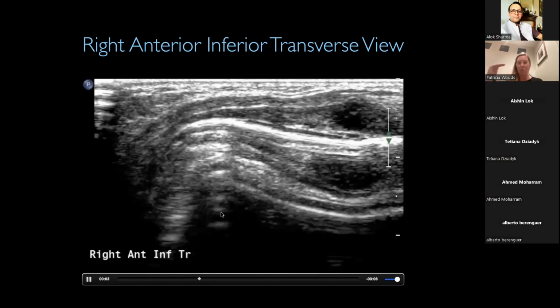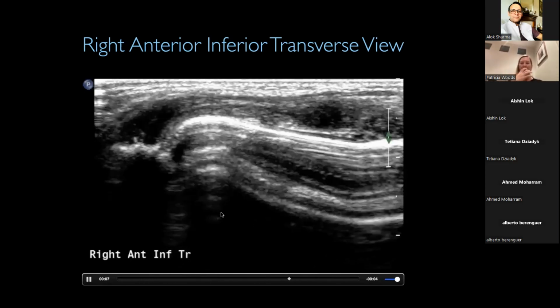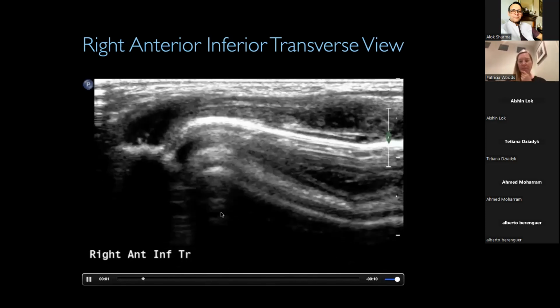It's not that beautiful horizontal movement. It's just this heaving movement up and down. And things like that can point way more towards air leak.